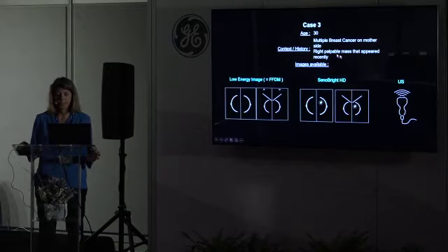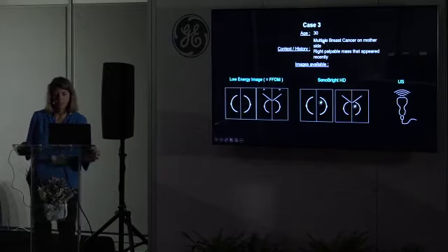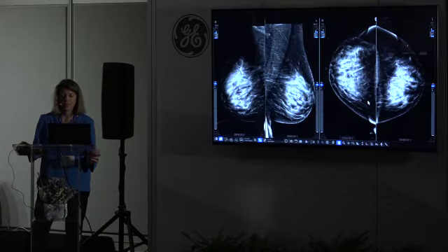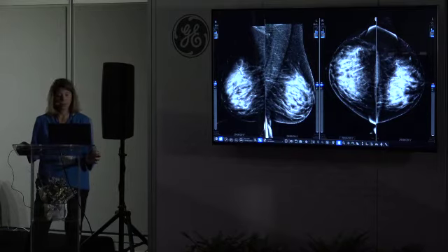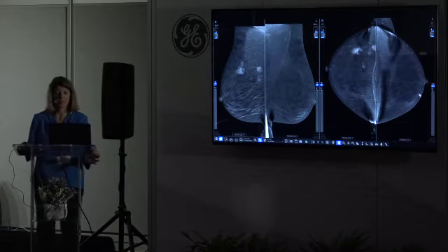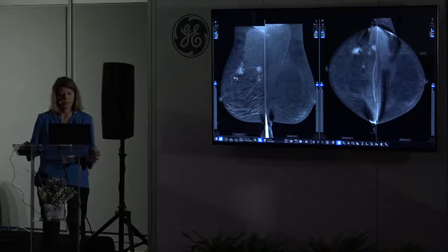Another case, a young woman. She had multiple breast cancer familial history on her mother's side and a right palpable mass that appeared recently. Again, a very difficult breast to interpret. I don't know if you see something suspicious. Right, left? Right. Yeah, distortion here, but quite difficult. Maybe here an additional one, but very difficult to see. And here it's clear on CEM.